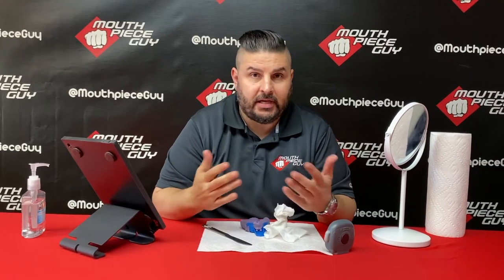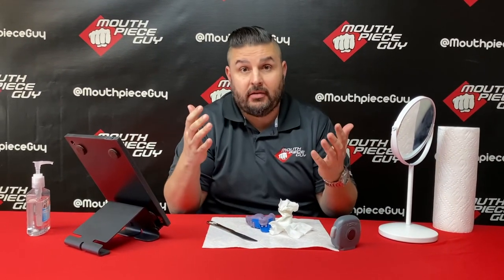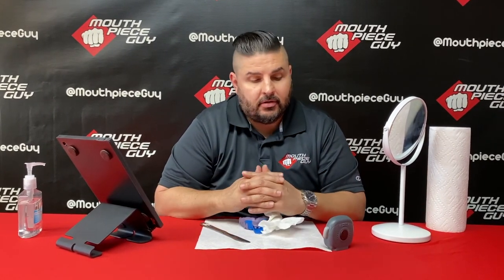So in real time, that's what taking the impression should look like. Obviously we trimmed out the middle where I'm just waiting for the timer to hit five minutes and 30 seconds, but for the most part that's it. Hopefully that helps.